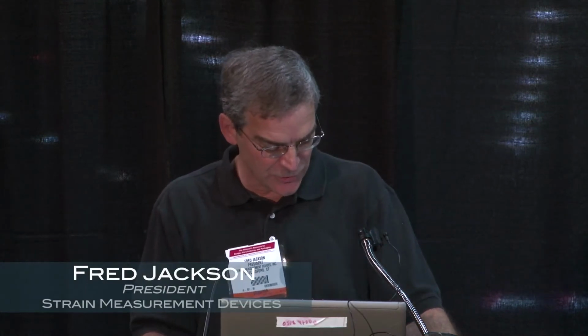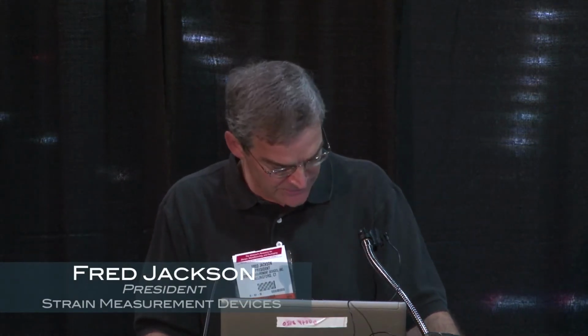The sensors include occlusion, air in line, liquid level, scales for weighing reagent bottles or flow, microfluidic sensors, and what we're going to talk about today are flowmeters.